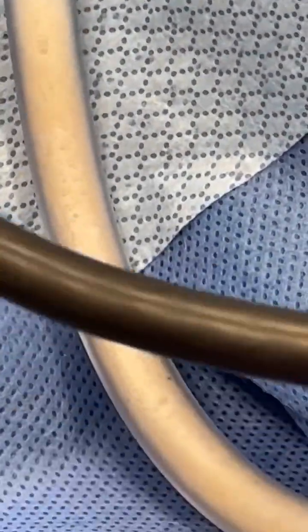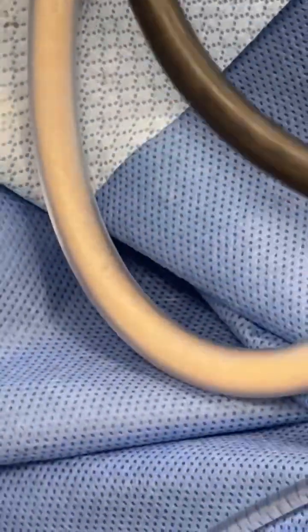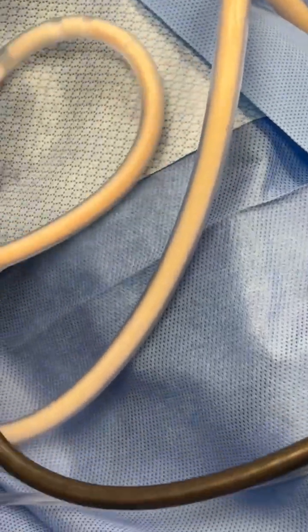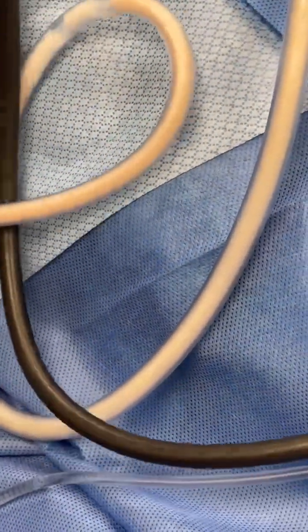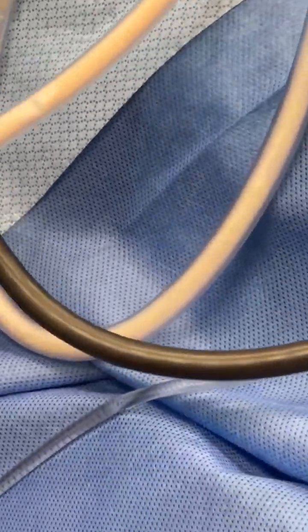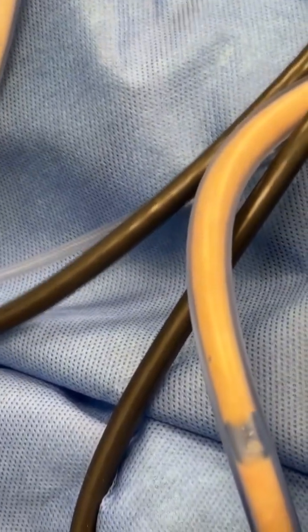And if she was going to have a fat transfer, which she's not, like I said, but if she did, look at this pure fat, it's going to survive. See, normally when you transfer fat into the buttocks, you lose 30 to 50%, but I contend that a lot of it is because it's not fat that you're putting in, it's fat and blood, or fat and oil. And doing it this way, you avoid the famous oil cyst on the buttocks.